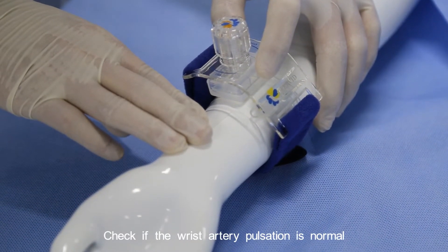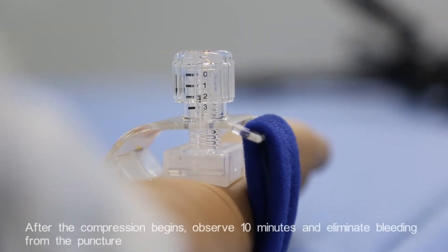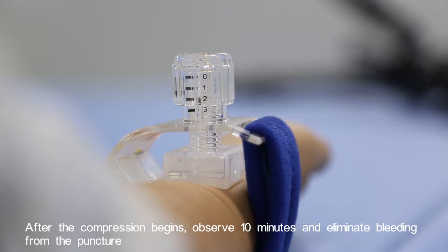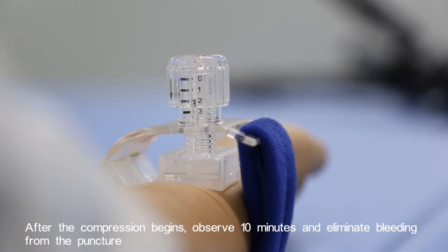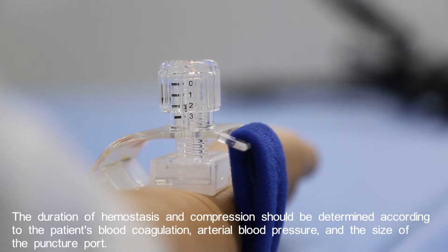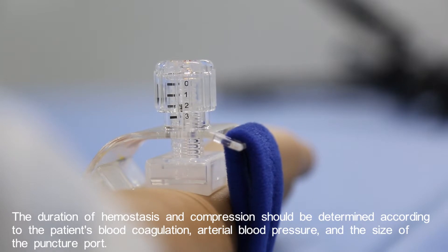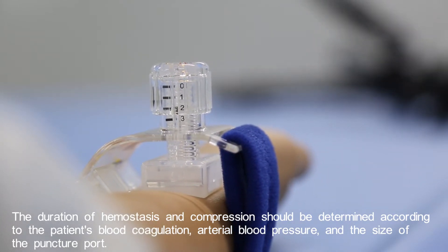Check if the wrist artery pulsation is normal after compression begins. Observe for 10 minutes and confirm elimination of bleeding from the puncture. The duration of hemostasis and compression should be determined according to the patient's blood coagulation, arterial blood pressure, and the size of the puncture port.